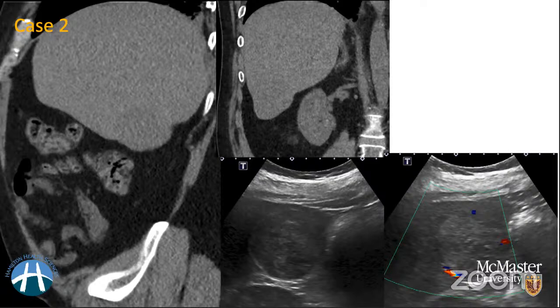I think if you refresh your screen, you'll be able to see the comments, because most of the time the feed is not live. So try refreshing your screen and I think the comments will show up. So Ayush is saying, could this be an FNH? Dr. Lin suggests, is it an adenoma? Avijit says, is it an FNH? So FNH and adenoma, those are the common differentials that people are thinking about. Correct. That's a really good list of differentials.